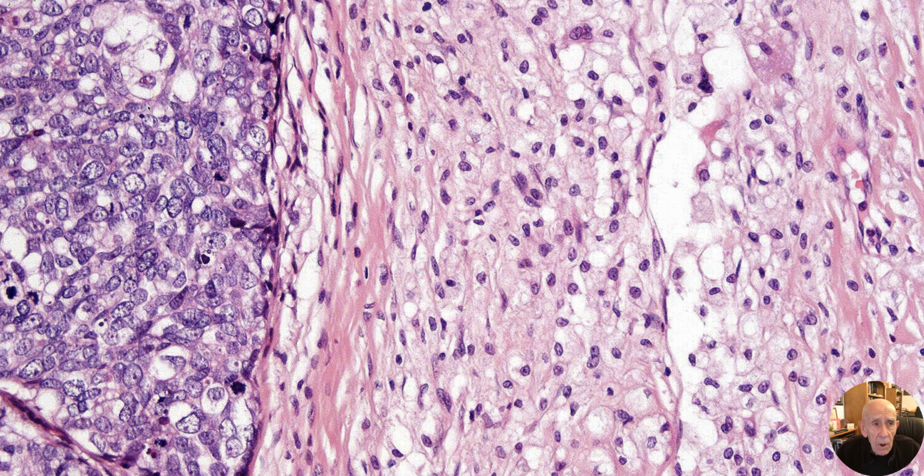There you see on top left of the field, there are well-formed sebocytes with multivacuolated cytoplasm. So when you look there, it's pretty obvious that it's a sebaceous carcinoma. Lots of mitotic figures. There are at least three mitoses, and you can see a bit of apoptosis as well. And on the right, these are actually histiocytes, which have been ingesting lipid that's been broken down from the necrosis of an adjacent tumor. But on its own, you might find that very, very confusing.